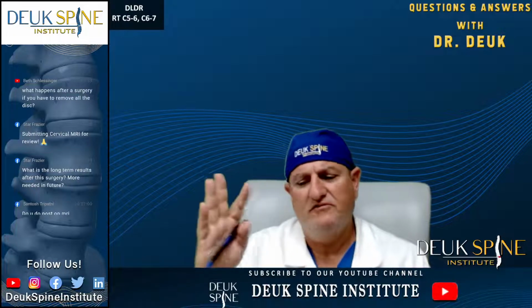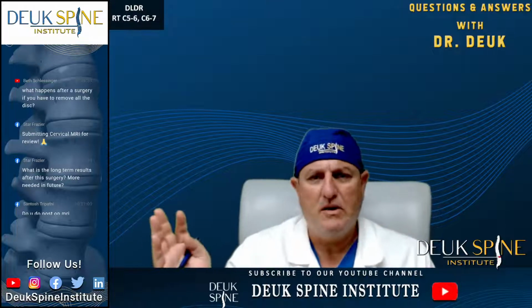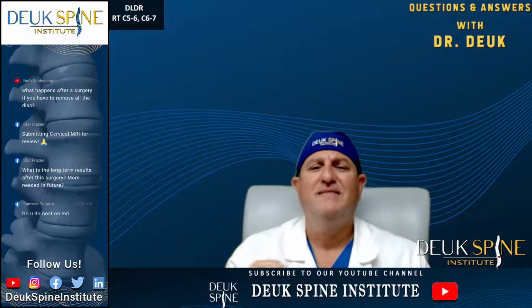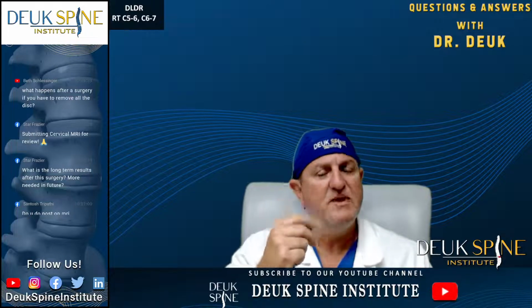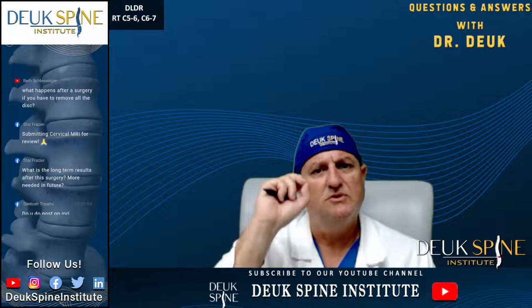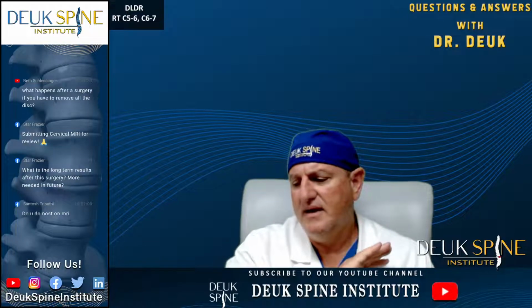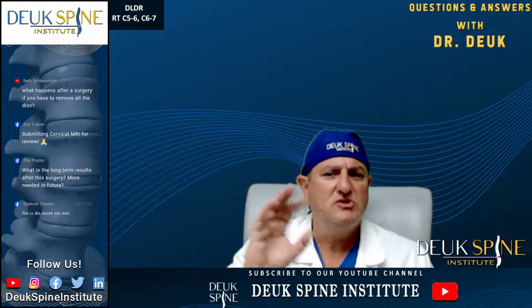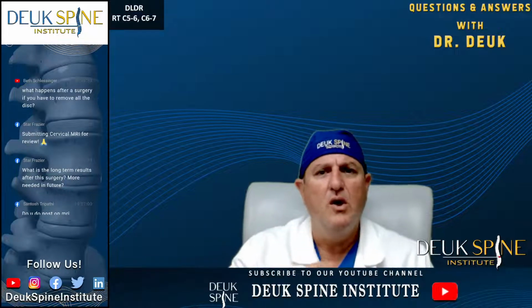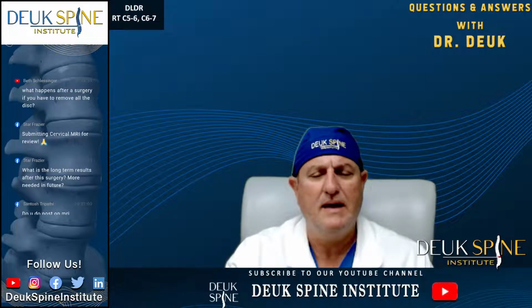So immediately, the first thing I did different from the Koreans is to knock the patient out completely with general anesthesia. That allows me to give a muscle relaxer so the muscles don't tighten up. That helps me to feel the spine better, so I know exactly where I am with that needle when I go in. It makes the surgery 1,000 times safer. The Koreans argue, well, if the patient's awake, they can tell you if you hit something. Well, they're not going to tell you if you hit their carotid artery. They're just going to have a stroke and die.